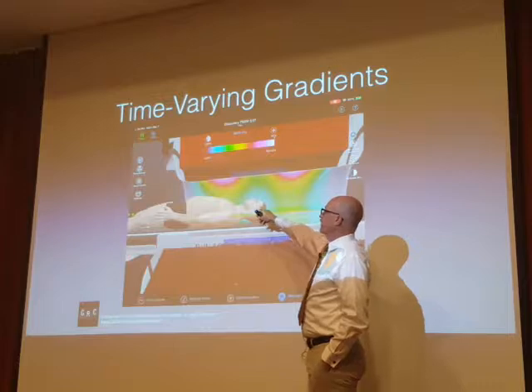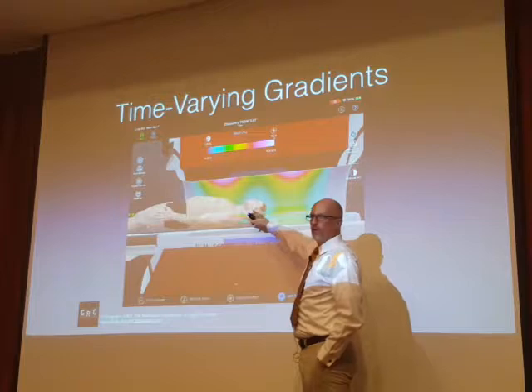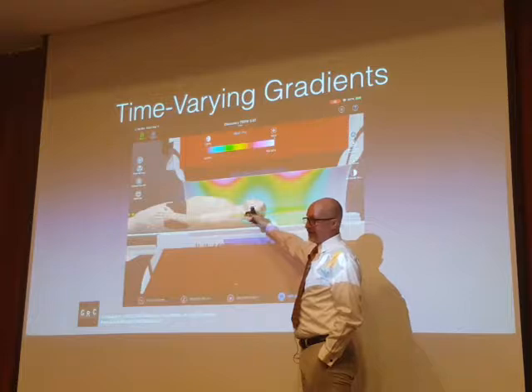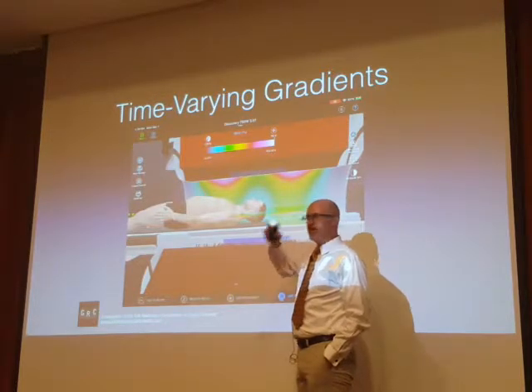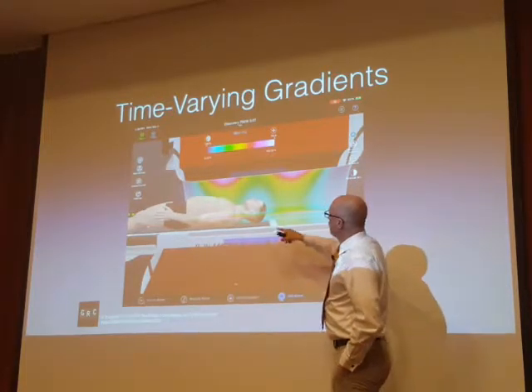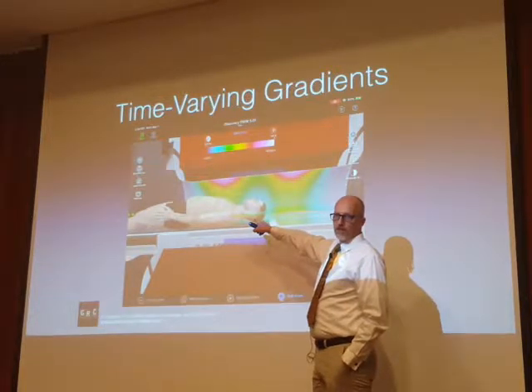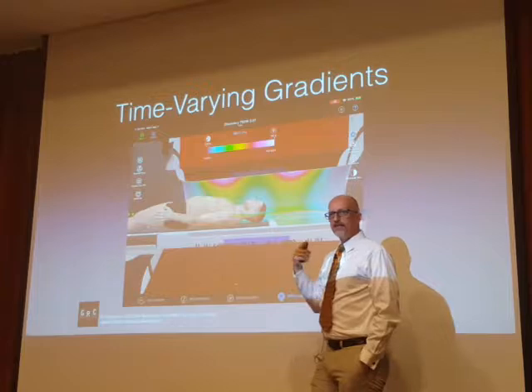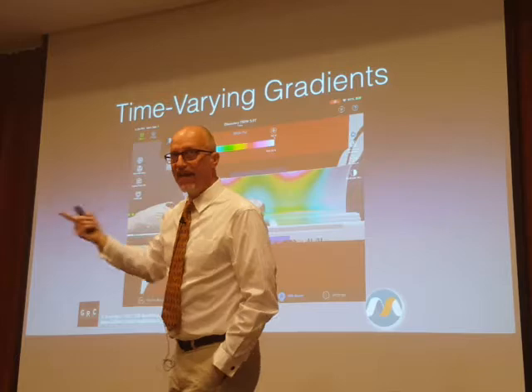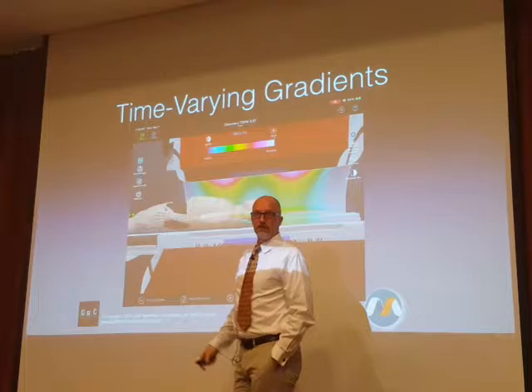So if we're imaging this patient's head, the time varying gradient within the patient's head is fairly modest. At isocenter, it's going to be close to 0. As we move away from isocenter, even just a few centimeters, we get some gradient, just not a huge amount. What this means is, if we're imaging this patient's head, the regions of the body that are likely to experience the greatest slew, the highest gradient amplitudes, are his chest and his arms.